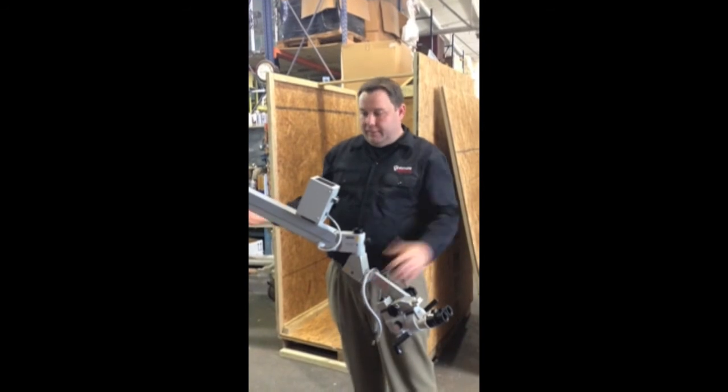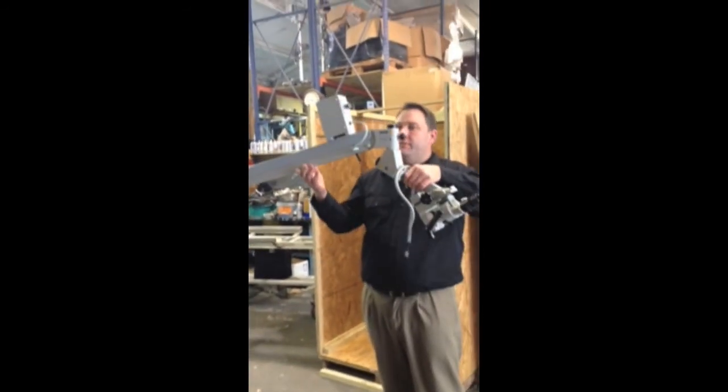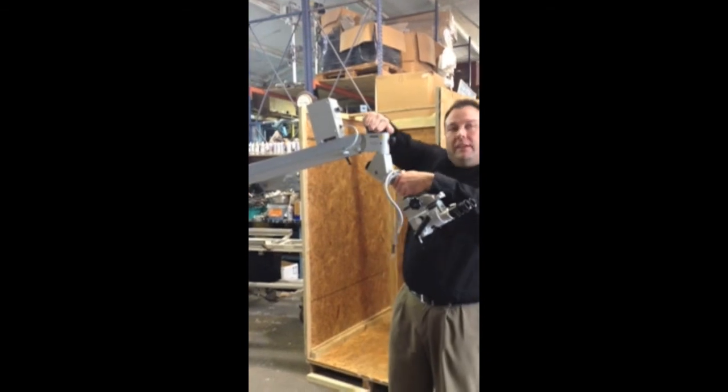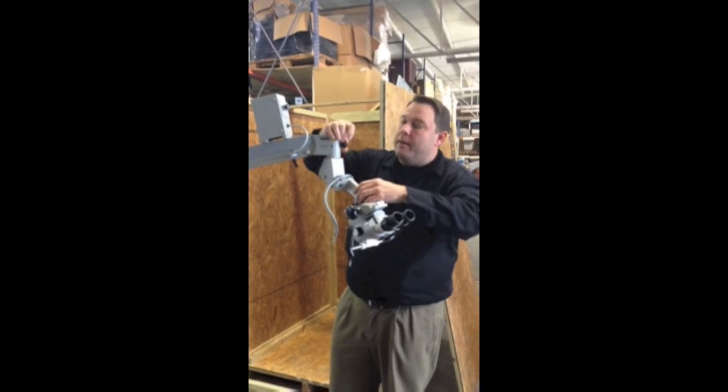Now that the head's counterbalanced, you can see that he can let go and the spring is acting like it should. You can lift it back up. Make sure this is very tight at the top — this is your most important locking mechanism, and this is a friction knob.